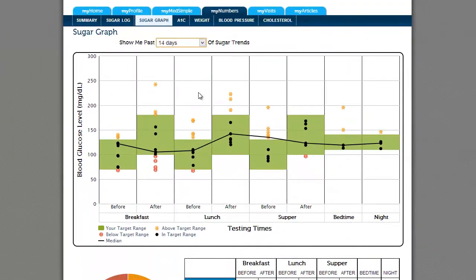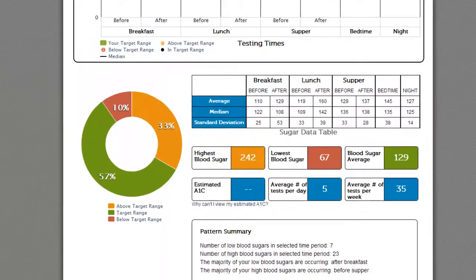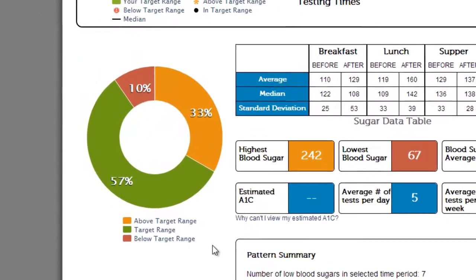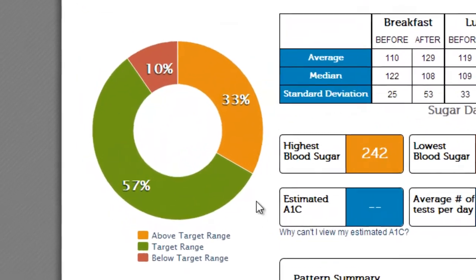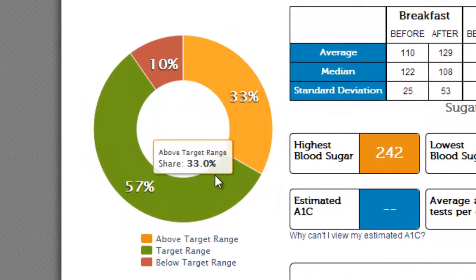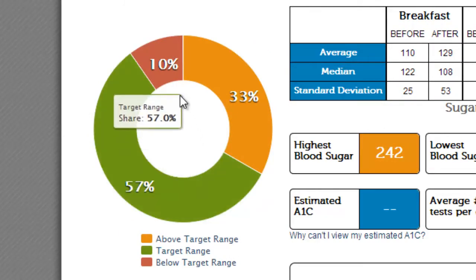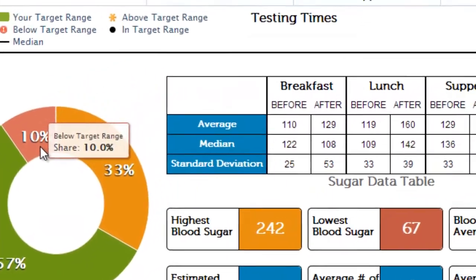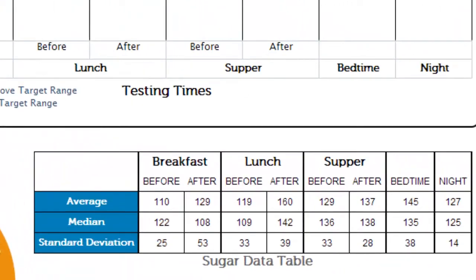Now let's scroll down. On the left-hand side of the page, you see a circle graph showing you what percentage of the time you are above, at, or below your target ranges. To the right of the circle graph, you'll find your average blood sugar for each day part, the median, and the standard deviation.